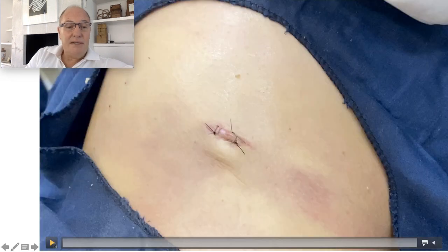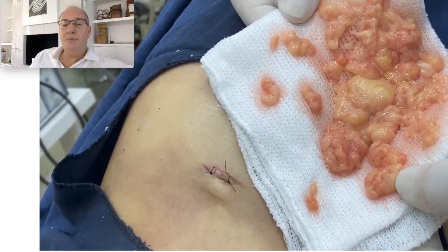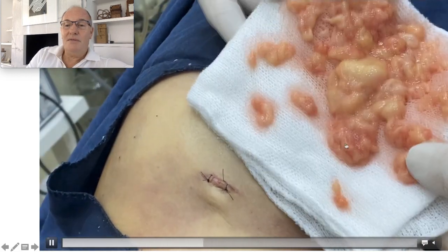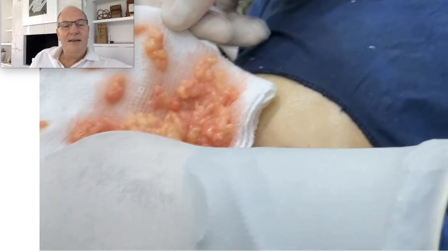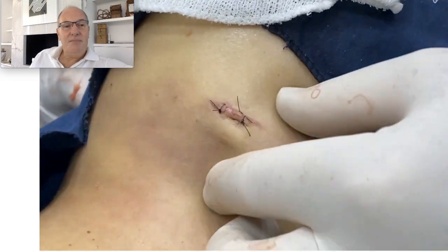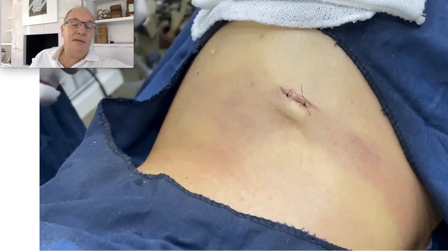This is immediately after the procedure, under local anesthesia, and we can see the full tumor removed — almost like a kidney shape. Each one of these I removed from this delivery technique. And you can see it is empty. We put compression, and the patient continues with her life.